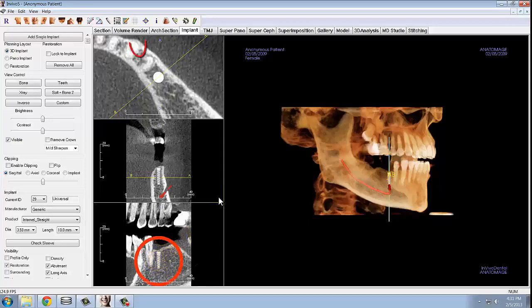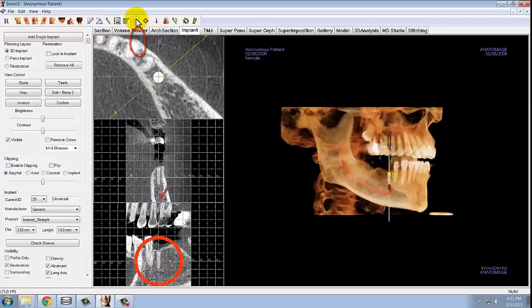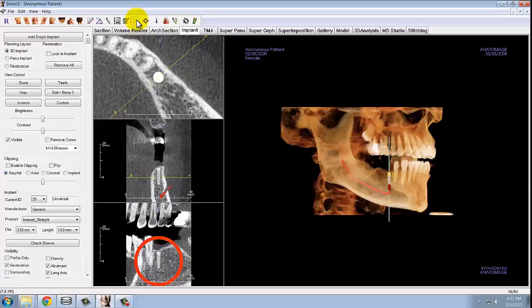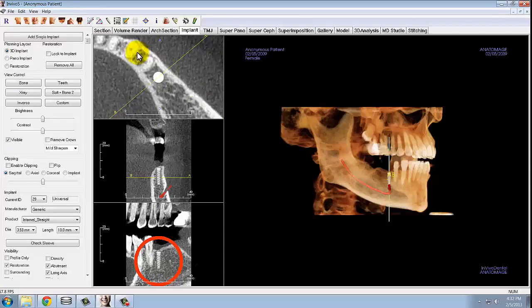The graph can be toggled on and off in order to place the implants more precisely. Again, you can always use the measurement tool to confirm whether or not you have enough space between the implant and the adjacent teeth, or between the implant and the buccal and palatal ridge.